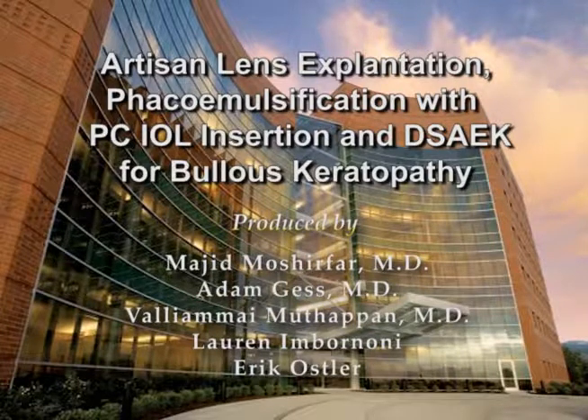This is a patient treated with explantation of an Artisan lens, cataract extraction with intraocular lens placement, and Descemet stripping automated endothelial keratoplasty for bullous keratopathy. The patient was treated at the Moran Eye Center at the University of Utah.